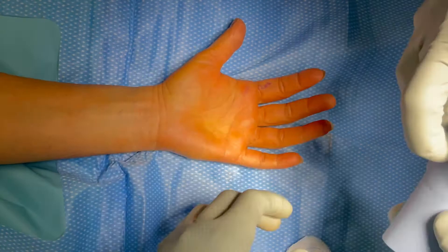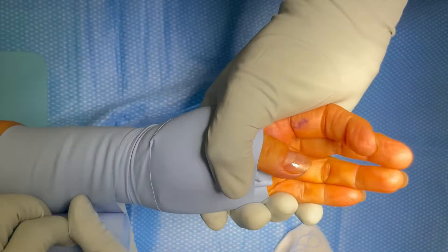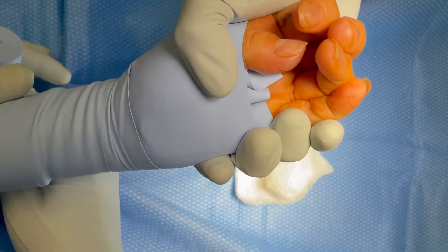By this point in the video you've seen us inject the local anesthetic. We are now going to use an Esmarch to exsanguinate the extremity and then raise the tourniquet to 250 mmHg to control the bleeding and prevent any excessive blood from obstructing our view during surgery.